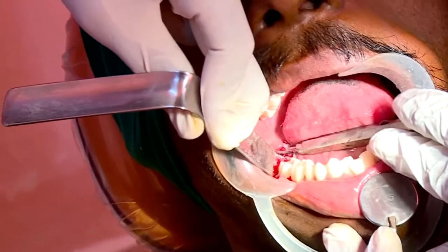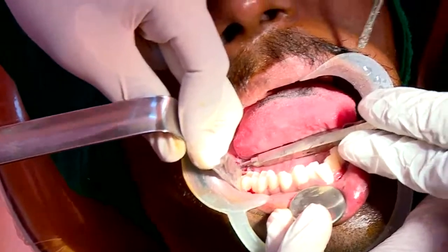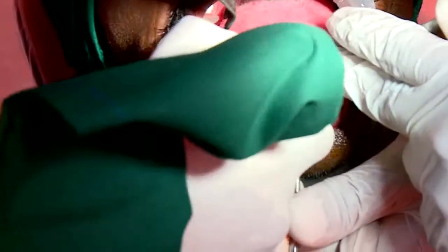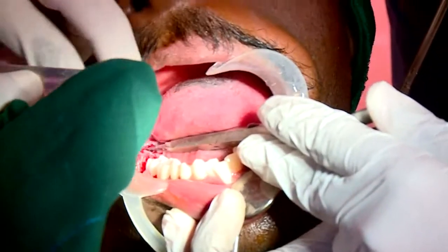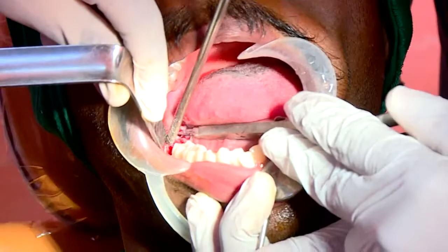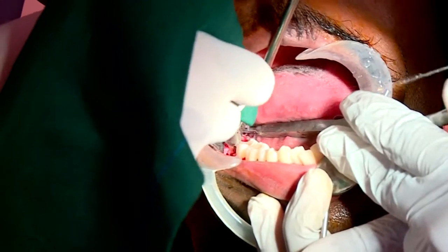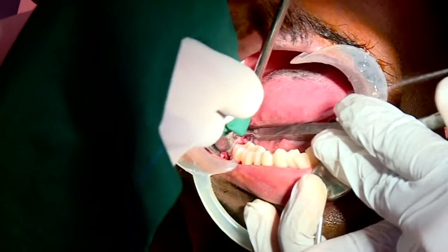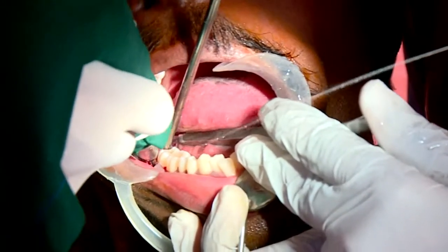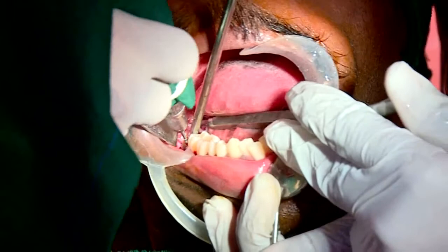Okay, make sure that you can see. Do not remove what you cannot see. That is the most important thing. Okay, in any extraction, if you are removing the root stump and you cannot see it, do not try to remove it. Okay, always we should be able to visualize what we are going to do. So if you remove the upper part of the crown, you can see the mesial part of the crown that is there, and any remaining space that is needed, we are doing it now, gaining more space so that the crown can be removed from it.